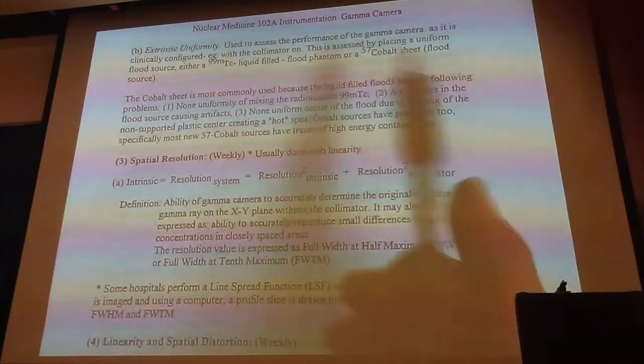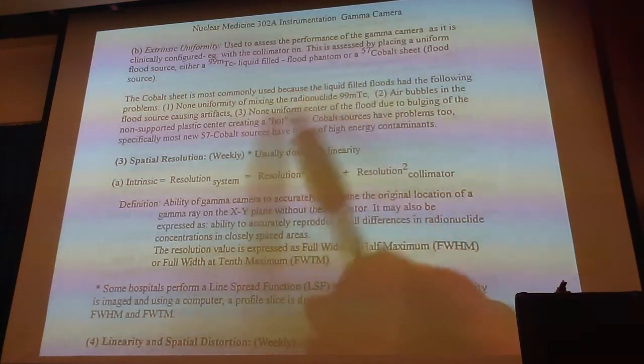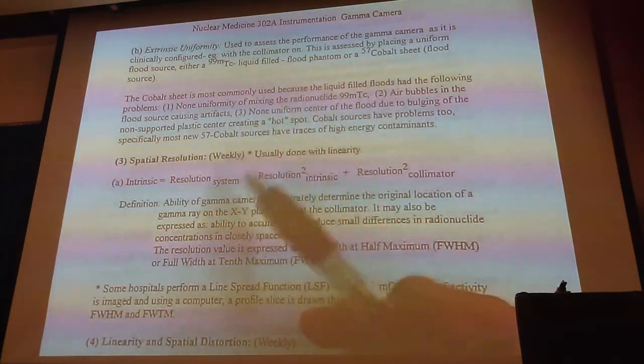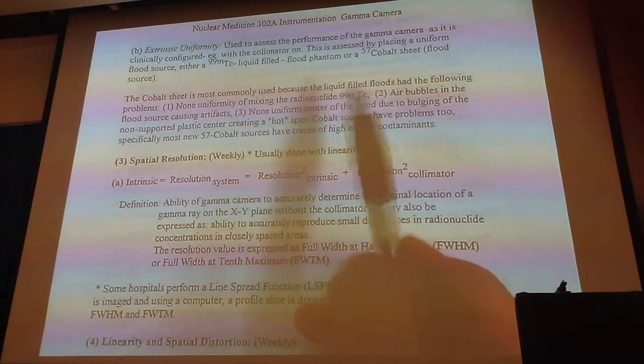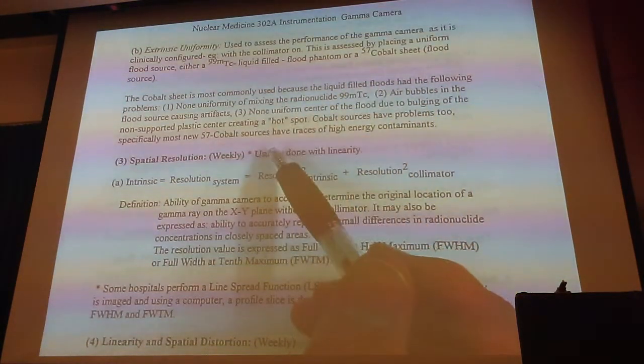And I put down here the cobalt is used more frequently because you don't get air bubbles in it. It's not as messy. You don't have to put it between your knees to squeeze the air out. You get a high radiation dose.